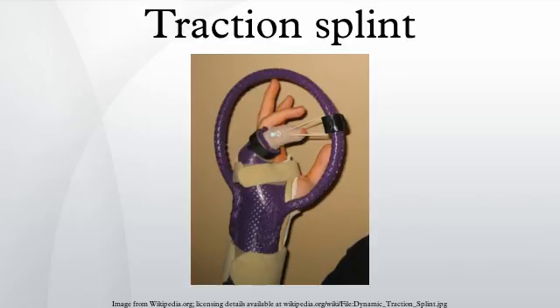The KTD eliminates the need for leg raising and unnecessary rolling of the patient, and can be easily applied to both pediatric and adult applications. It consists of a round pole that can be located on the lateral aspect of the leg, with straps at the upper thigh and ankle for immediate placement, and 3 wider straps for immobilization. It is very light at 20 ounces. The KTD does not afford the rotational stability normally seen in long bone traction splints.